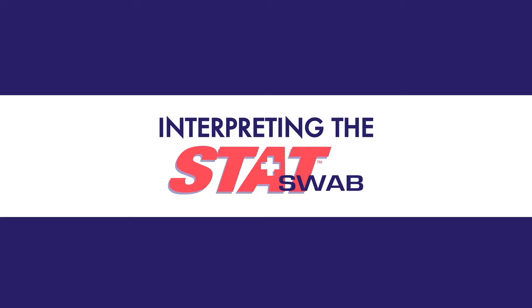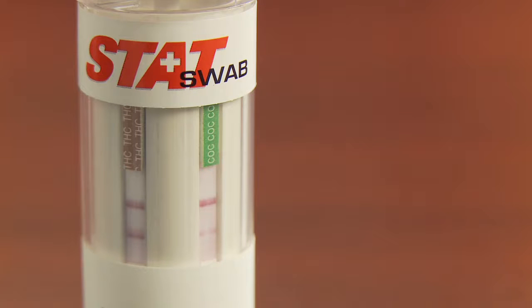Interpreting the STATSWAB. To interpret the results of the test, look at the test result window. There will be a control region along the top of each strip and a test region along the bottom of each strip. Interpret the presence or absence of the line in each region. One red line should appear in each control region under the corresponding drug abbreviation. This is an indication that the test has run properly.